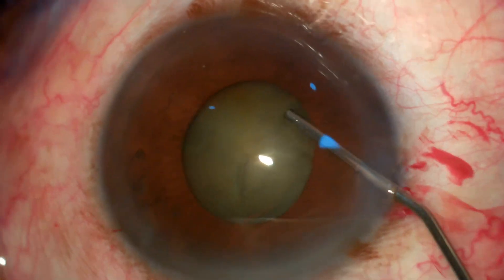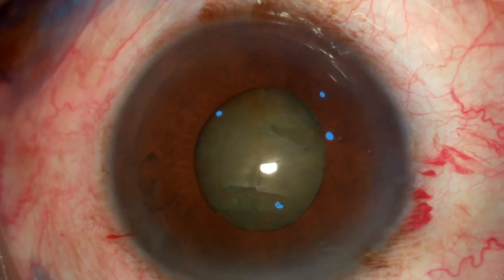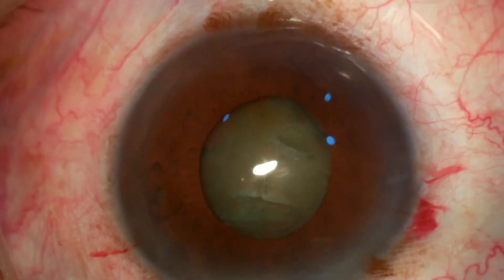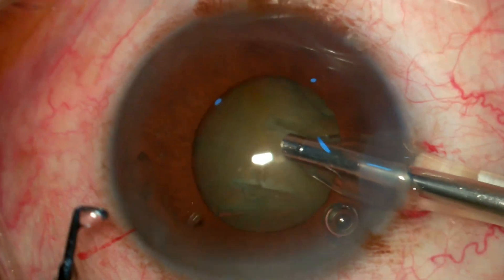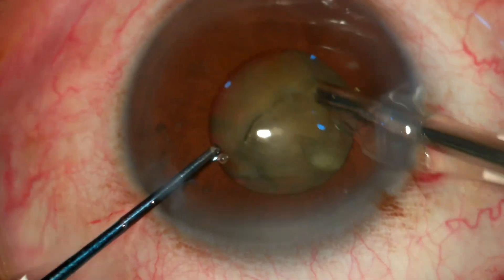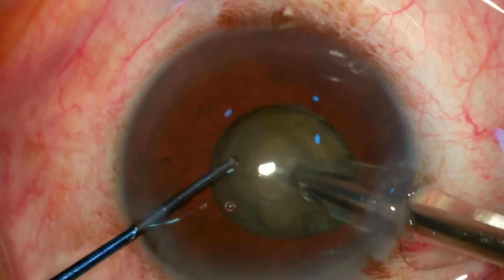I'm expressing the excessive viscoelastic from the anterior chamber before my hydroprocedure, as hydroprocedures in these patients are very tricky because we cannot see the fluid wave and this is a dense nucleus. So I'm doing a little bit of hydroprocedure.